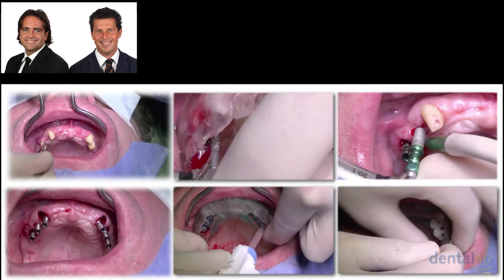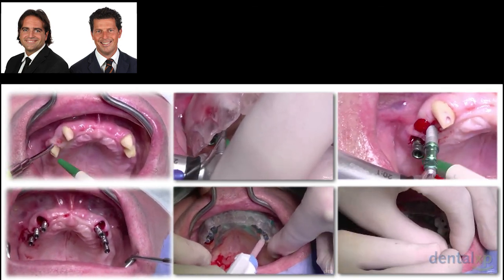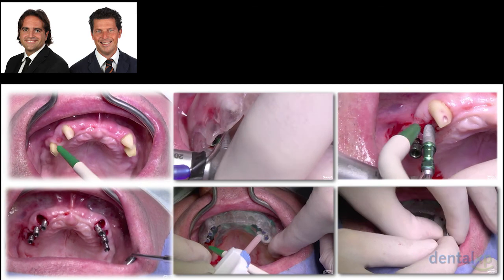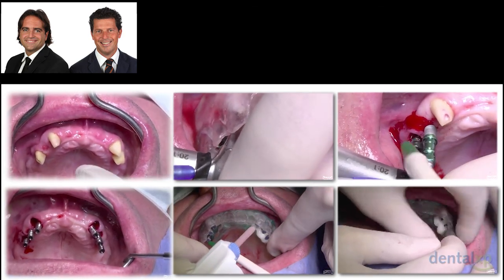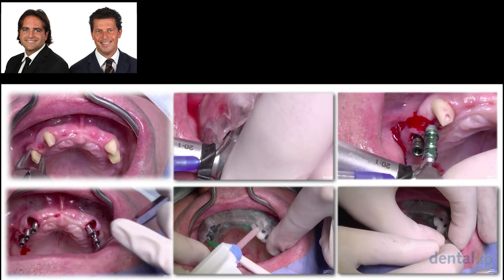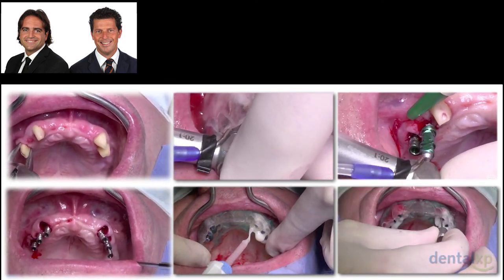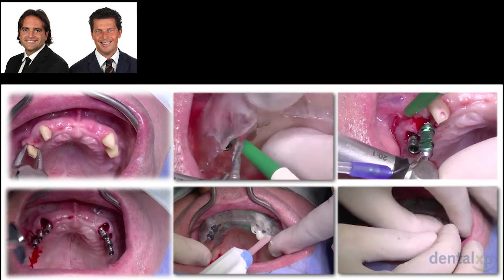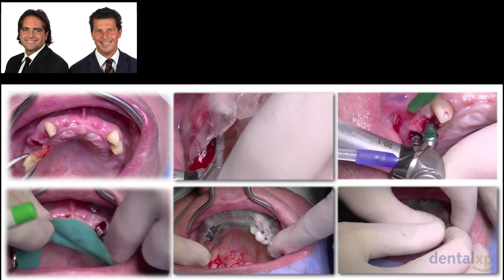And here you can see the traditional approach, so the traditional transfer of the implant position to our dental technician, thanks to this transfer plate. This is a published article together with Maurice, Henry and David on the revitalized solution. This was what was done in the upper arch, something that we already tested and know about.